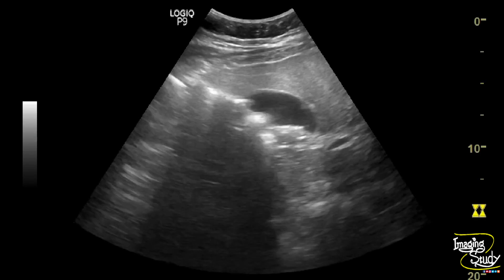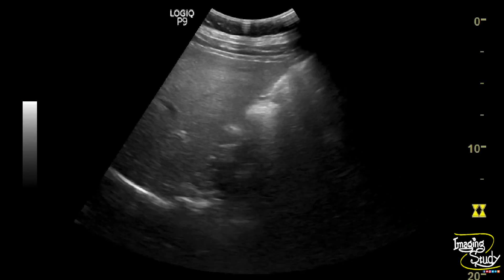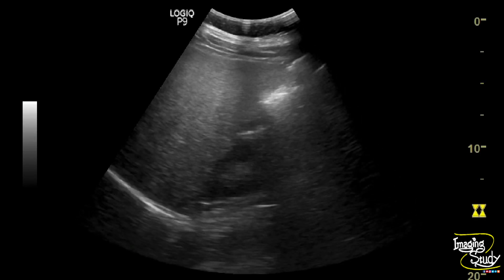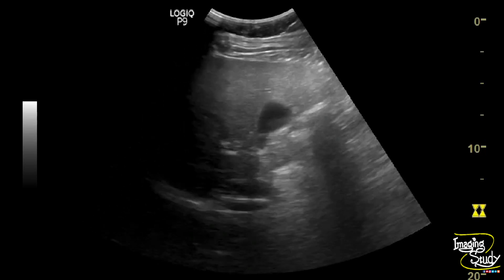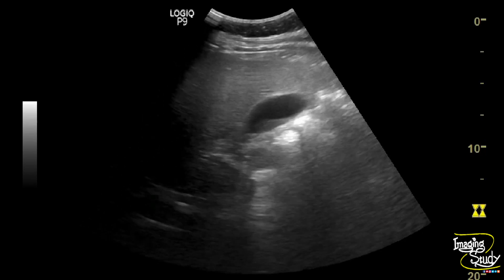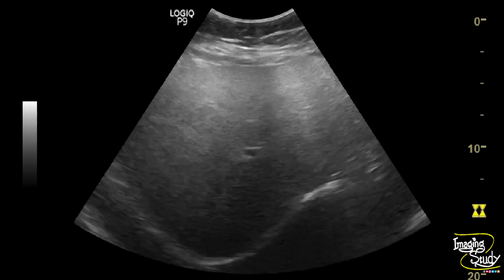This hyperechoic parenchyma with mild attenuation of the sound beam, along with well-visualized vessels and diaphragm, indicates this as a case of mild hepatic steatosis.